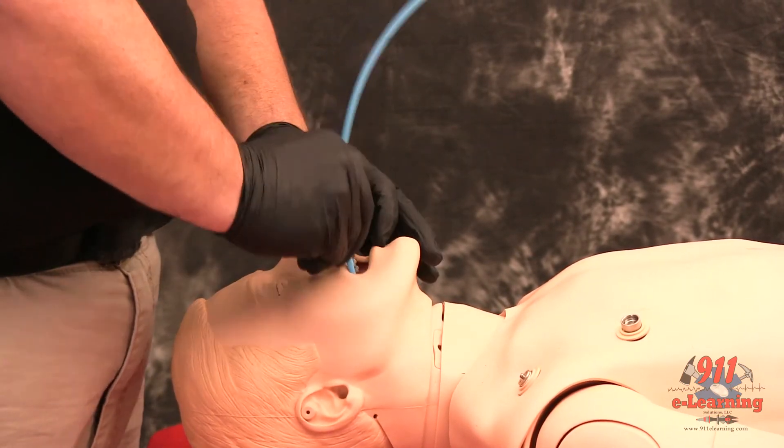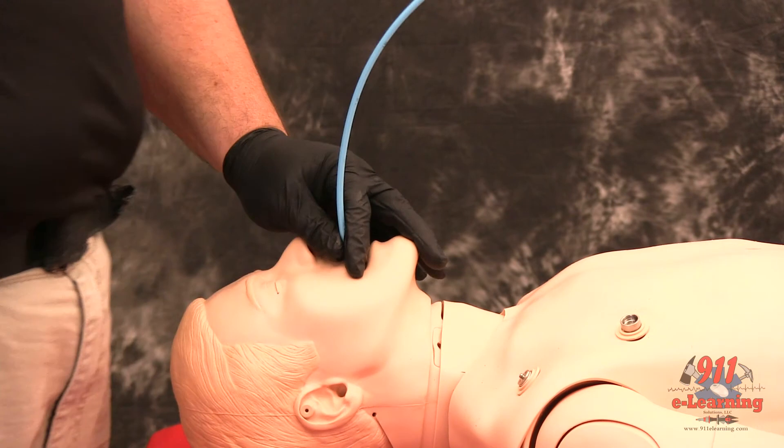If you do not meet resistance, you have a probable esophageal intubation, and insertion should be reattempted or the failed airway protocol implemented as indicated.